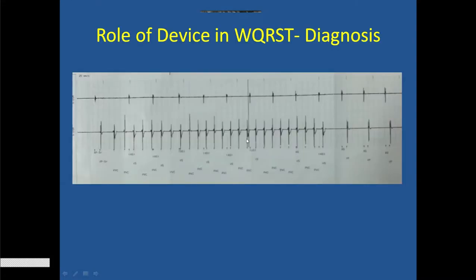The patient is already on an ICD, and we are ablating somewhere inferior septal and also lateral, and this is the coronary sinus catheter. This is the ICD in place. This is how we do the cases.